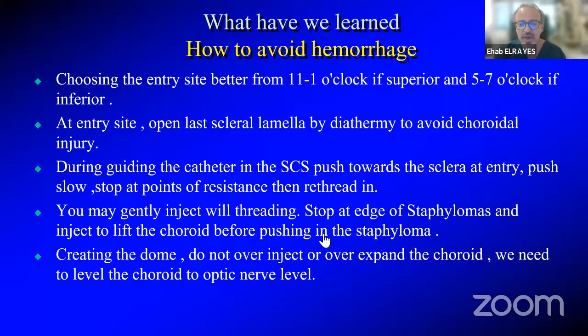Create a dome and never expand the dome to make it high. You need to restore or bypass the staphylomas. Don't over-indent, whether you're putting a scleral macular buckling or using a suprachoroidal macular buckling.